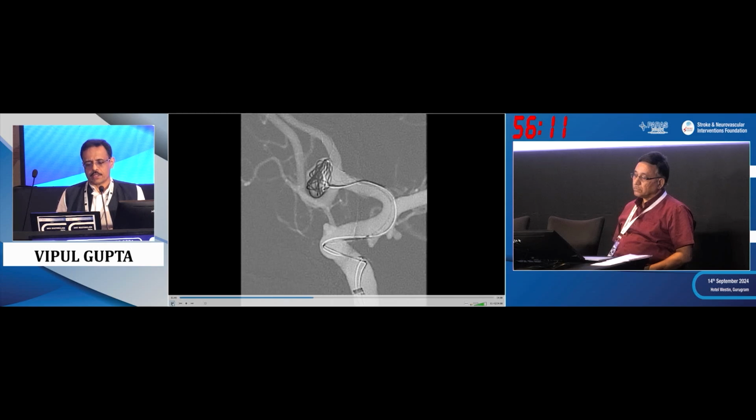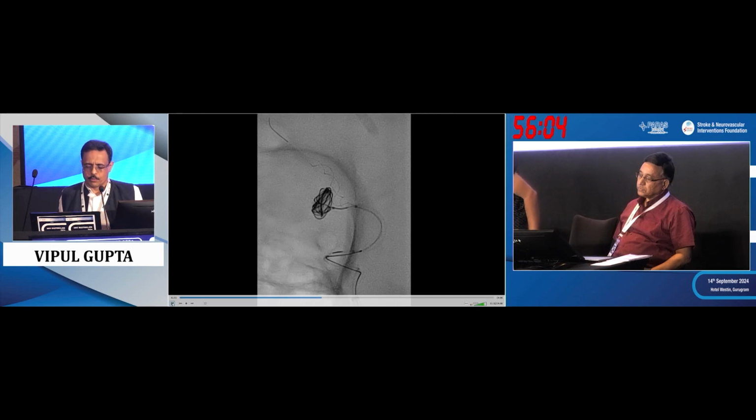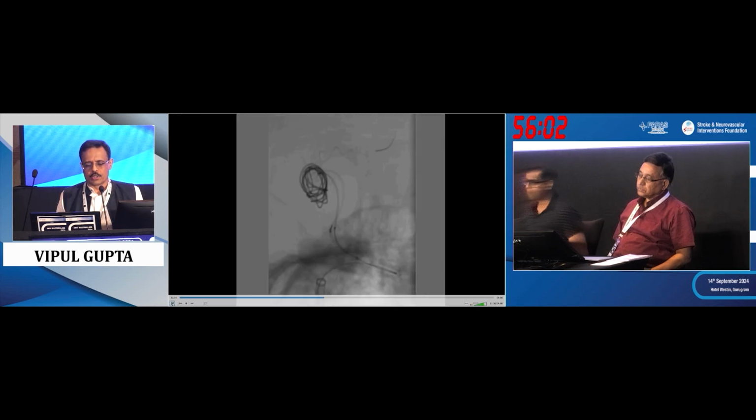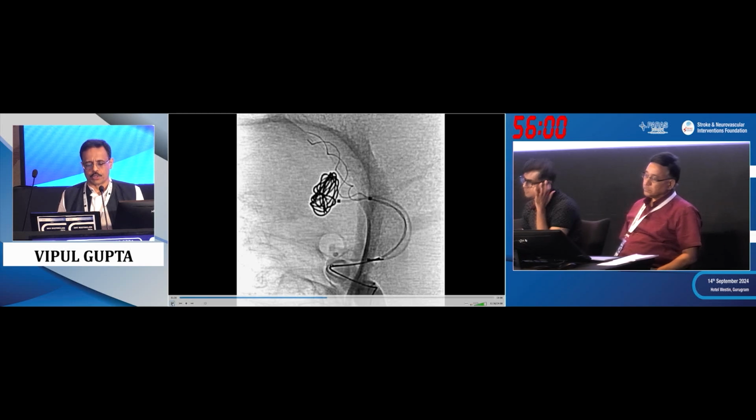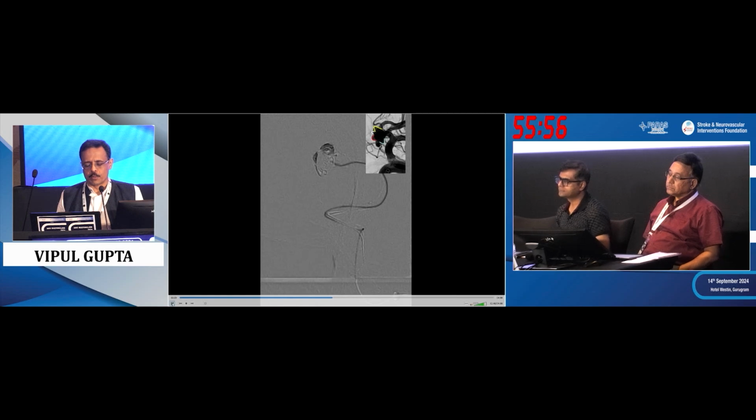So now you can see we have created a surface where we have got a good, nice first coil which is hugging all the walls, which is very important. Long first coil to us is becoming very important. 2 views hugging the walls, otherwise one is in trouble. And you can see we use multiple small coils.